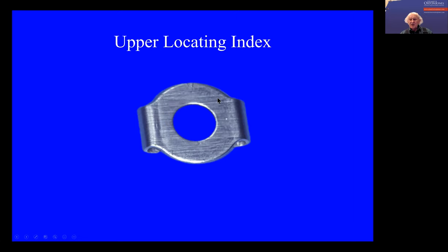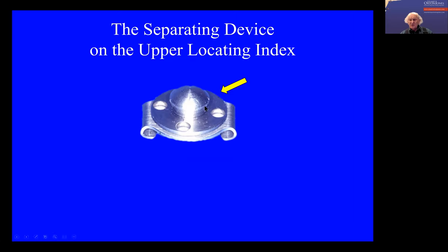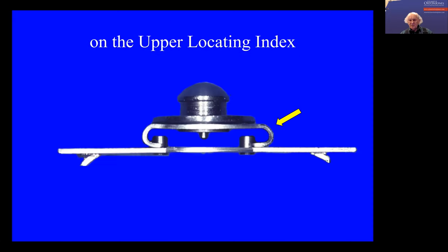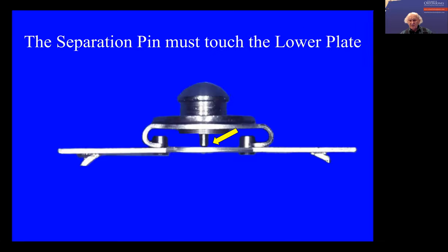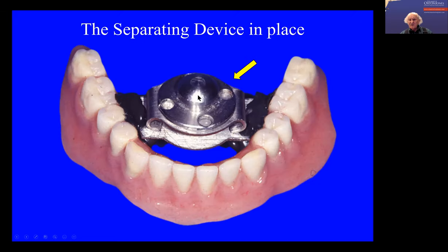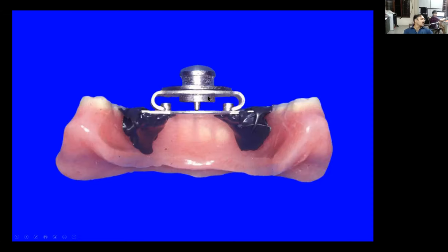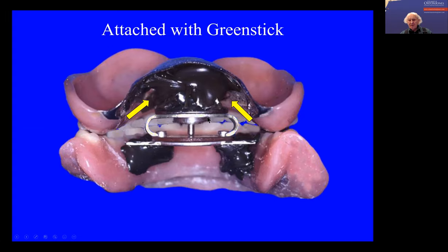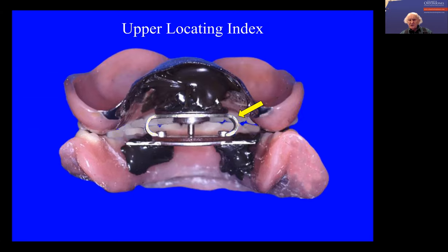Now you then put this little locator — the upper locator — on top. And it fits onto that lower plate like that. So this fits onto the lower plate, and the upper device fits onto that. You then put the dentures together and put green stick here like this. When you do this, you have to make sure that the upper locator is still fitting onto the lower, because this is all warm and it can contract and separate, so you have to keep pushing it down. This is in occlusion at the moment.